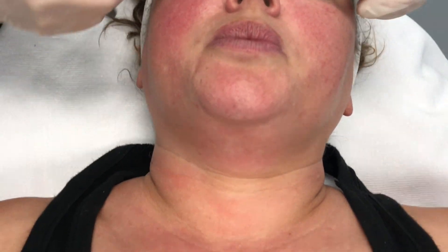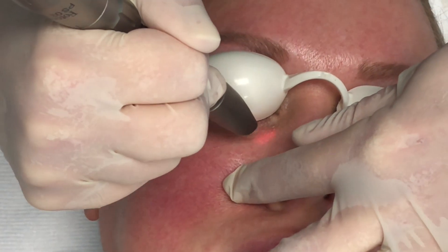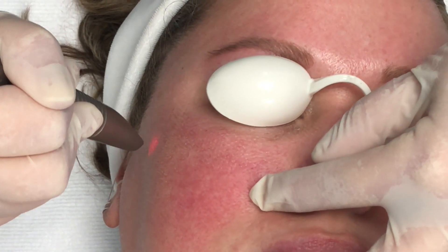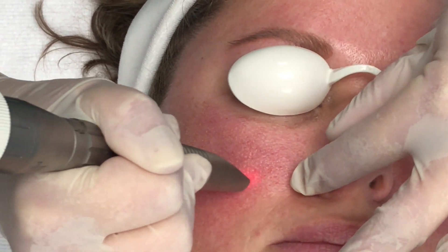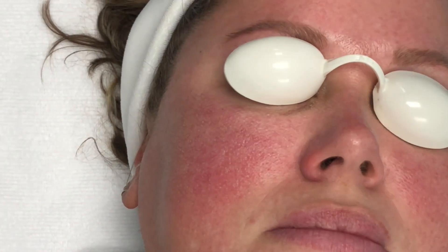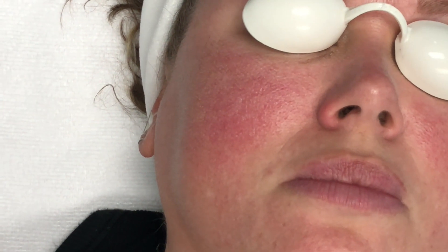You can do some nice tightening around the eyes with this, even though it's very light and gentle. You'll see a little white, pearly finish to the skin when you're done — that's the dead skin cells you're just going to wipe off. You're going to do this everywhere, one pass over the chest, neck, and face. You can make a couple extra passes over anywhere where there might be a fine line, just to give a little more resurfacing.